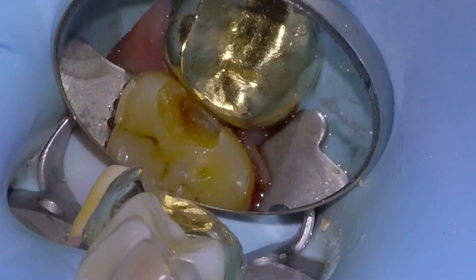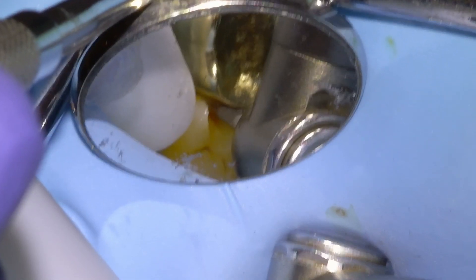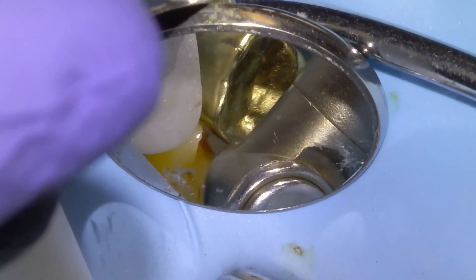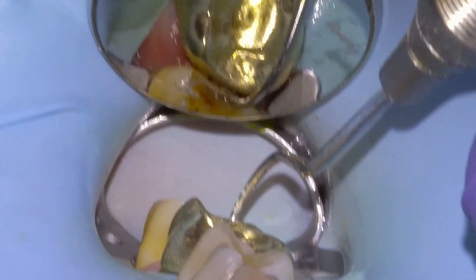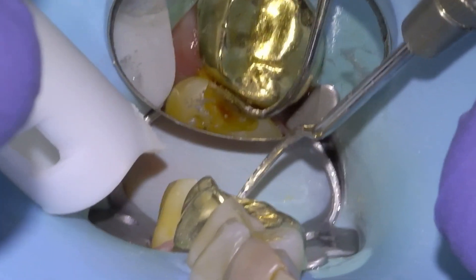So the lingual contact is open. We'll open up the buccal proximal contact, and we're mostly using indirect vision for the whole thing. And then once the buccal is open, we'll open up the gingival proximal contact, and there's some food down there that we'll pick out.